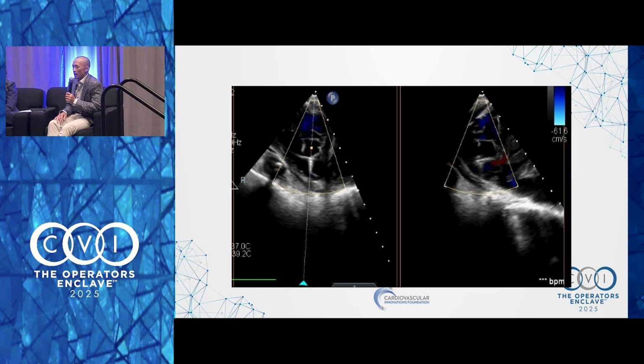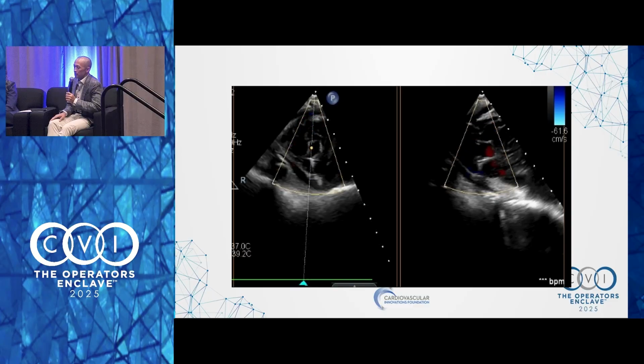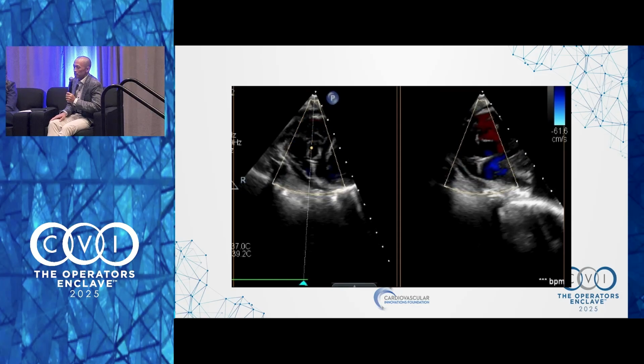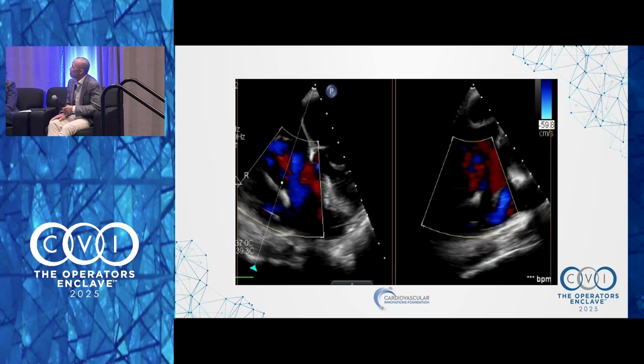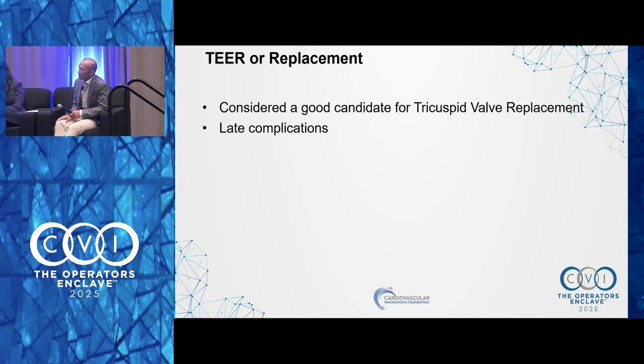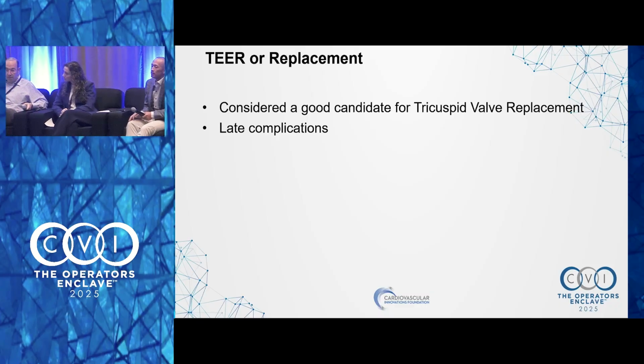So here, I thought it was actually creating that gap. I don't know if you feel like that, but I think we agree. It's creating a gap, right? This looks like lead causing TR, not lead-associated TR. And to me, this is a lead removal case. Would you all agree, Nadira? You agree? Definitely from the transgastric view, you can see it's really pinning it down.